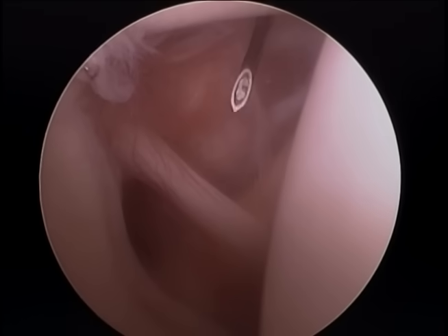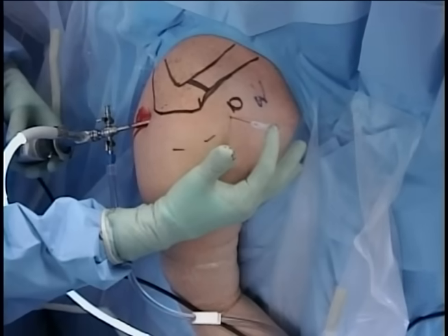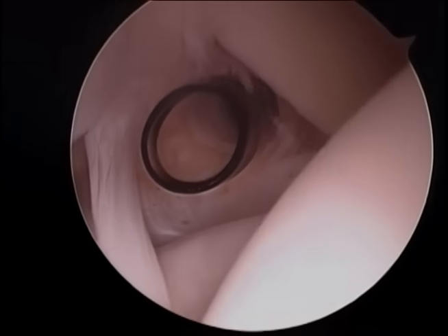We are in the joint and immediately create an anterior portal in the rotator interval with the spinal needle. We are lateral to the coracoid. We make an incision and then insert our plastic cannula. You see the orange tip coming through the tissue. We use this cannula to pass instruments in and out of the joint.